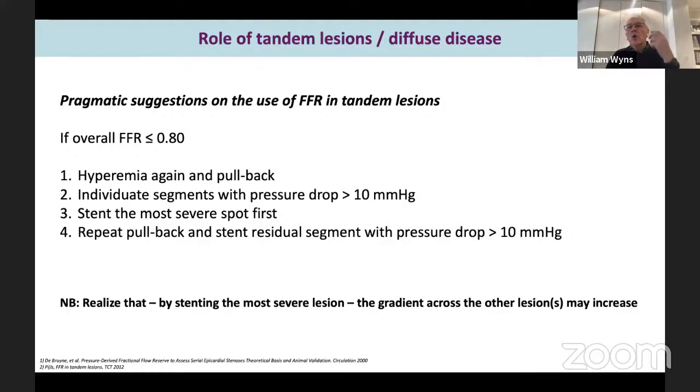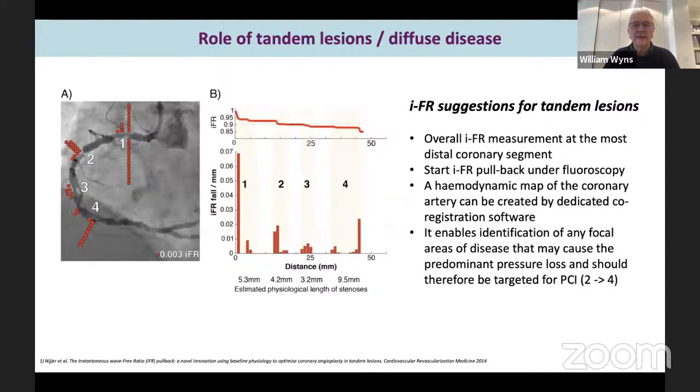Okay? Now, what we have been missing for decades is co-registration of the pressure tracing with the anatomy. And fortunately, we have that now. And it's available both for iFR and FFR. And that's very, very critically important. If you remember just one message from this, what matters is not anatomy alone, it's not physiology alone, it's both, co-registered, because then you can really identify which are the segments that don't have normal conductance and how you can fix them, if they're fixable with stents. Drugs, of course, and secondary prevention will play a role as well.